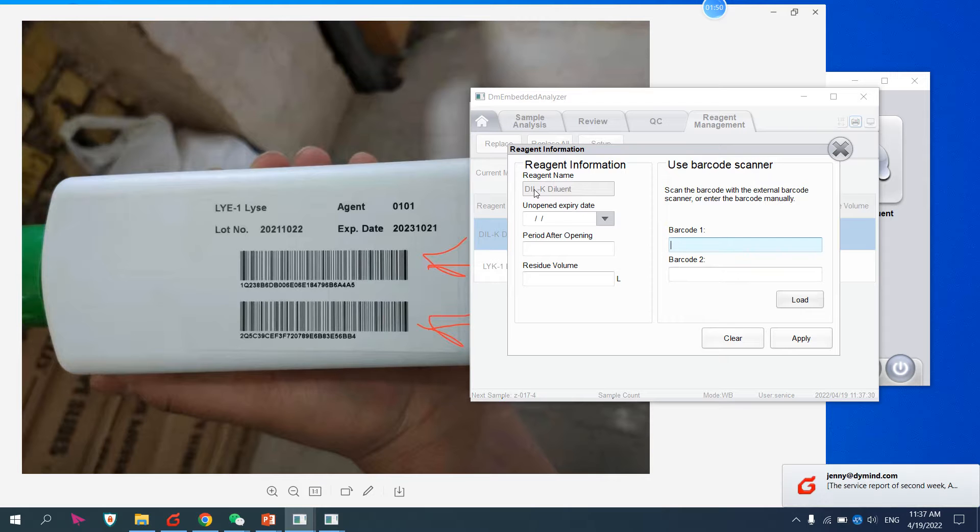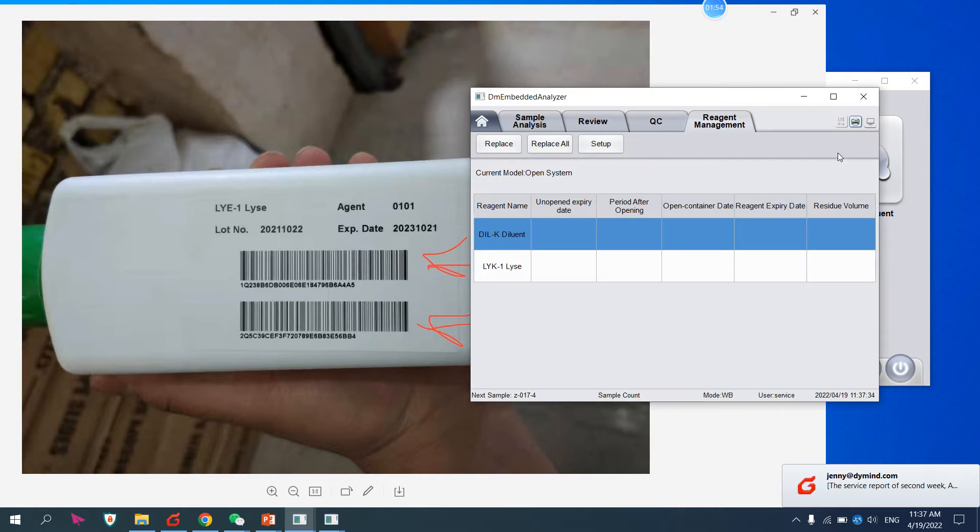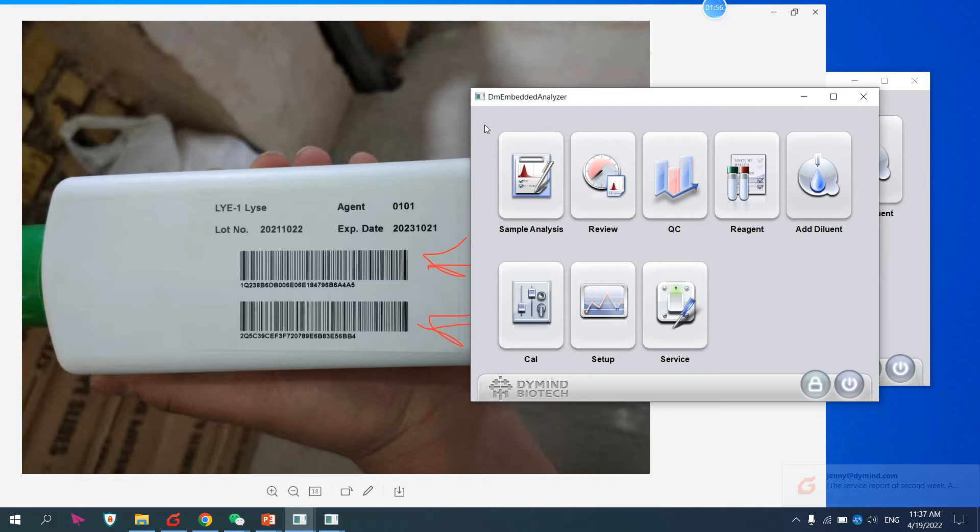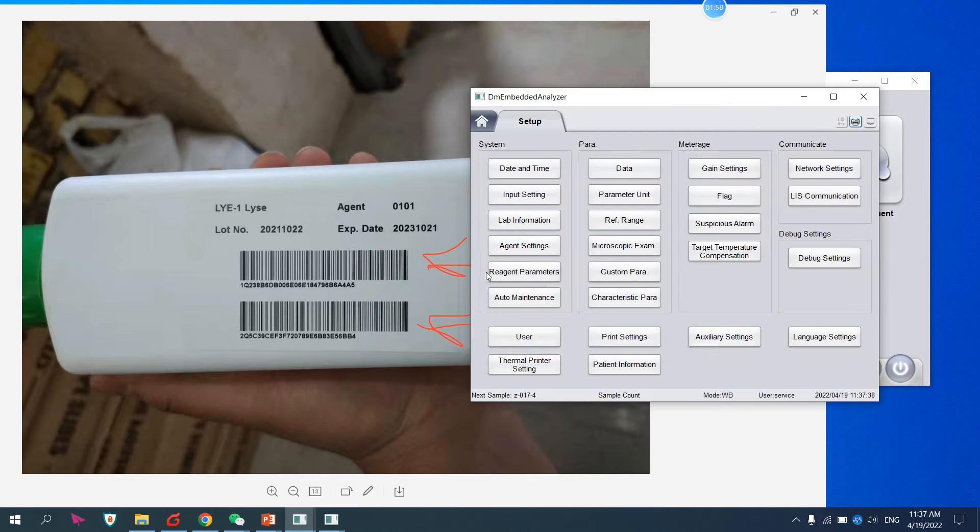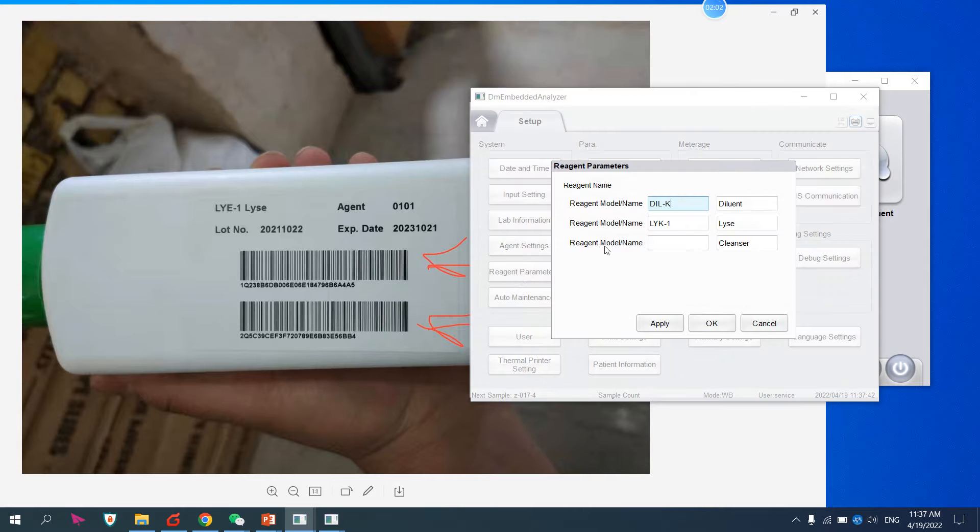Here you can see this is for diluent. If you want to change this name, like the diluent, you can change it according to your requirements. If you want to change, you can change from here: setup reagent parameters. For example, this is diluent.